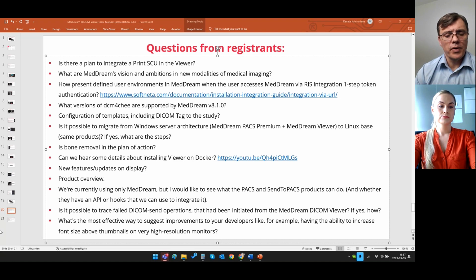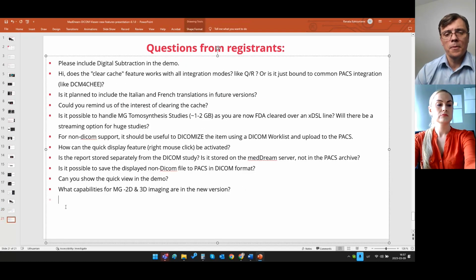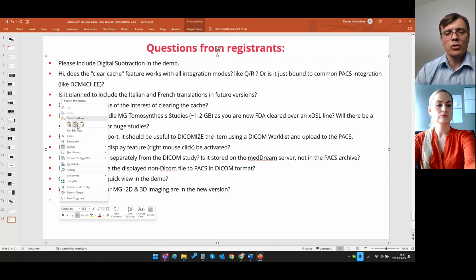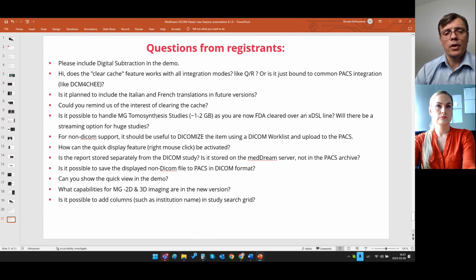So the easiest way, of course, is to try to explain your needs in a very detailed way with print screens and images and a comparison of what you are missing, because this would give you a bigger chance that our team will understand what you need and can give you the right estimation with the right sketches. So be as precise and as detailed as possible, and then you will get a better result.